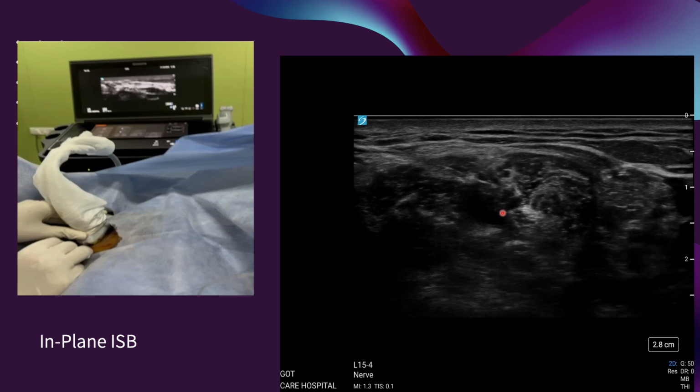So that's the local anesthetic, and you can see the spread on one side of the plexus. It's not necessary to make multiple attempts or try to encase the plexus with local anesthetic on both sides. The important point is to notice that the brachial plexus sheath is not a diffusion barrier. In other words, the local anesthetic placed outside the sheath easily diffuses and anesthetizes the nerve roots.